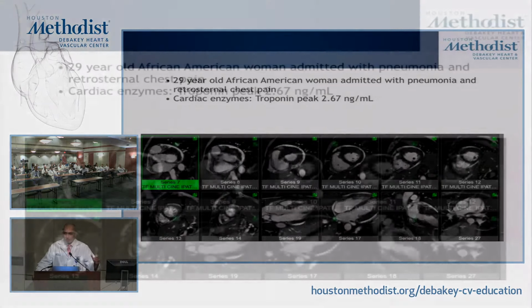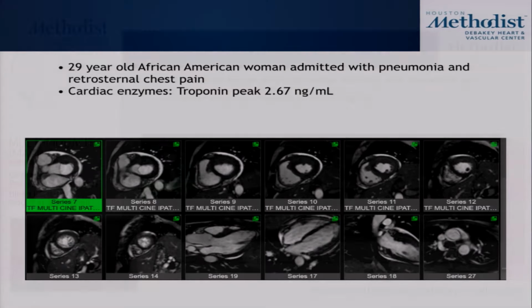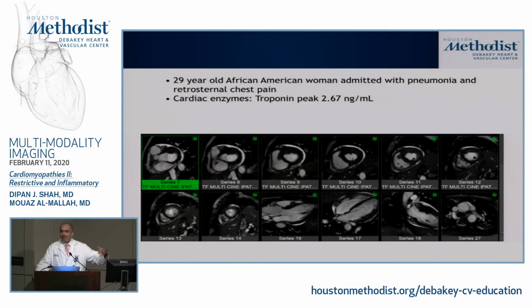So one is regional. And again, you always want to be careful because hypertrophy would suggest that there's myocyte hypertrophy. All we can tell here is there's increased wall thickness, right? It could be from the myocytes hypertrophying versus it could be amyloid, for example. It may not actually be myocyte hypertrophy, but rather protein deposition. So what you see here is that there's regional increase in wall thickness, right? And it's predominantly in the anterior wall.